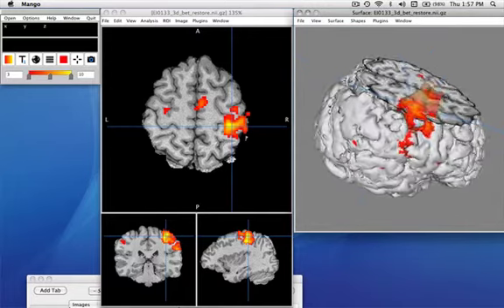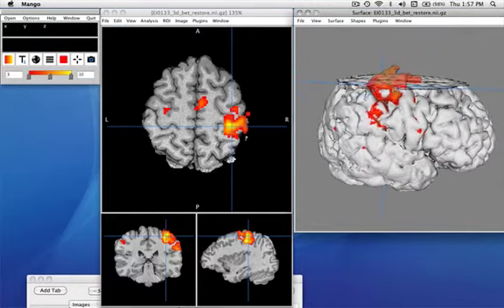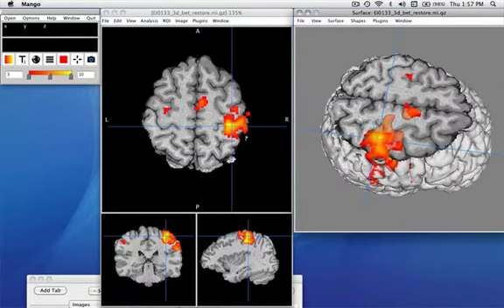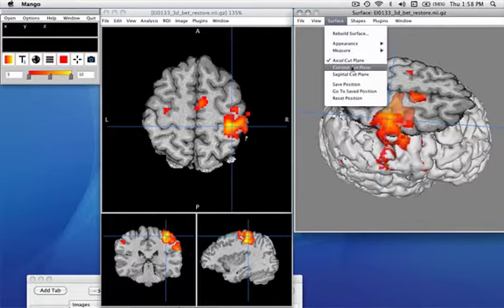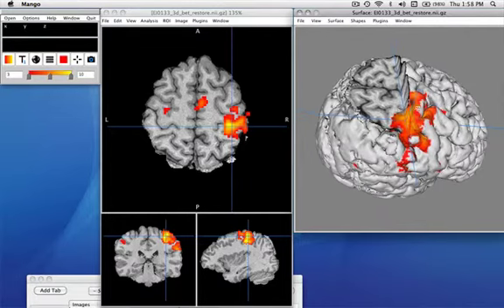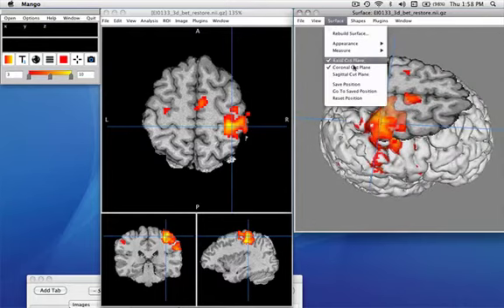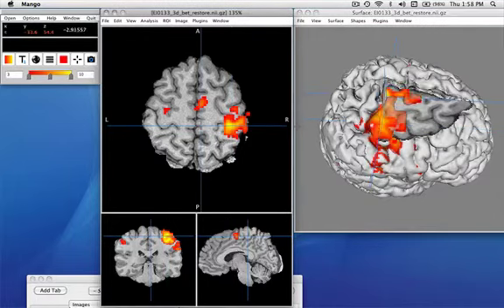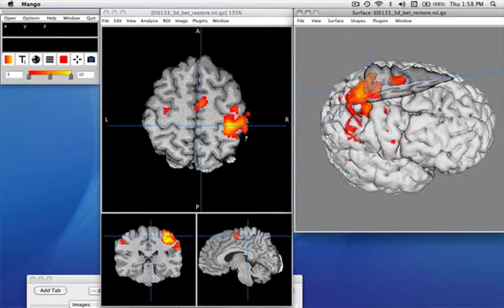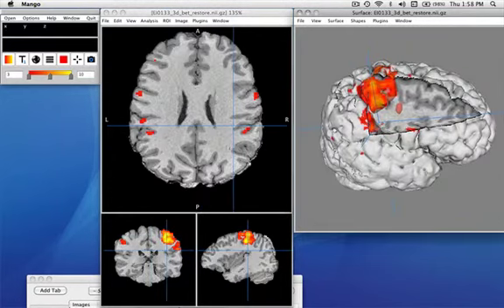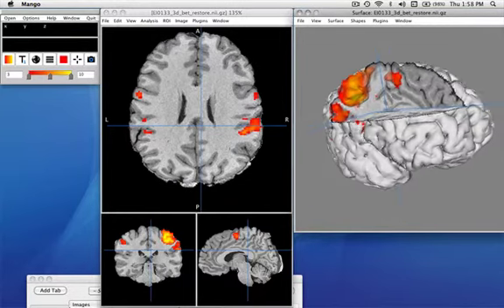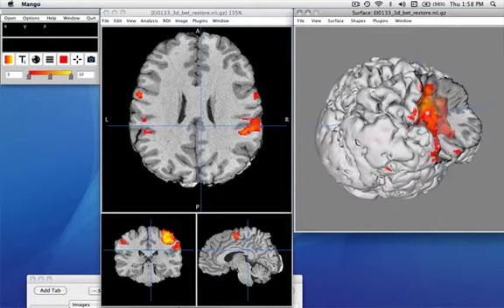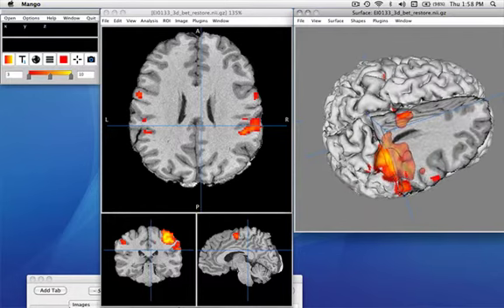Now we have similar color mapping onto the shapes as we have plotted onto the surfaces as overlays, and we can see the actual data inside the images. Sometimes it's useful to add a few more cut planes — we'll stay up in this area and add the sagittal as well. I'm going to move the sagittal plane in a little further. So now we've got a reasonable idea of the 3D distribution of the brain activity in this particular study. This is a study involving finger sequence learning with the left hand.